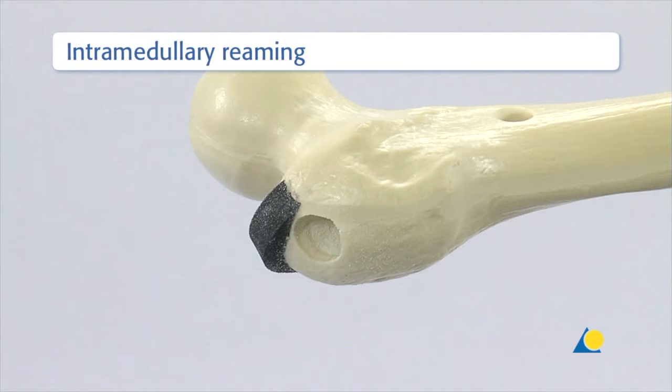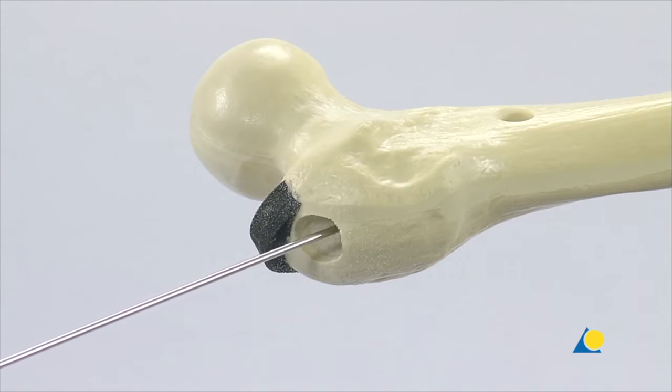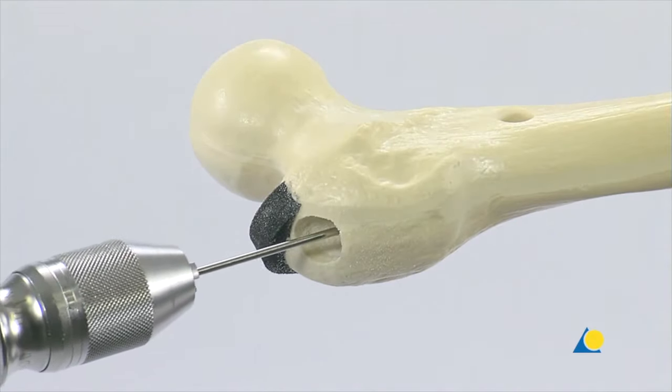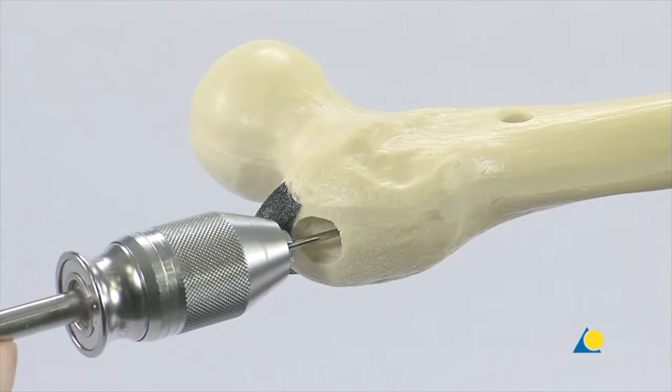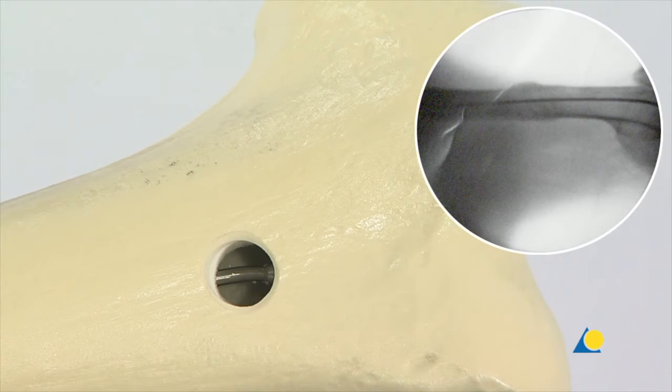To accommodate the nail, the medullary canal is now enlarged to the required diameter with the medullary reamer. The synream reaming rod, with an olive at its end, is carefully inserted into the medullary canal using the universal chuck with T-handle. While rotating the rod back and forth, the rod is eased across the fracture under image intensifier control. The reaming rod must come to rest centrally above the notch to prevent a varus or valgus deformity. Care should be taken that the rod, in the lateral view, is also placed in the centre of the canal to avoid perforation of the anterior cortex. The correct position of the reaming rod in the distal femur is checked in both planes with the image intensifier.